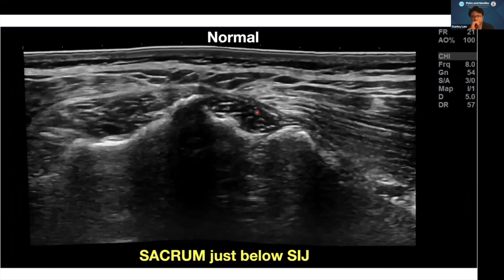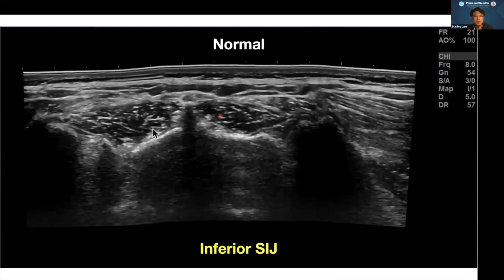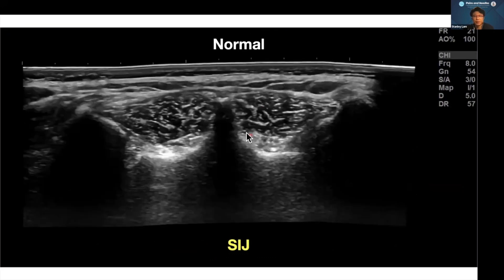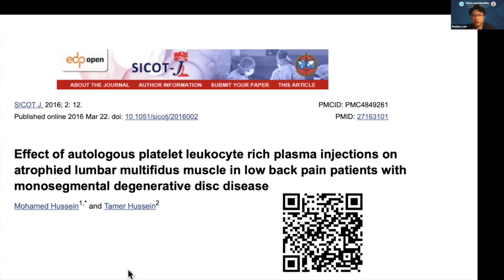For comparison, this is the sacrum of a normal individual — my own lower SI joint. You can see my multifidus and gluteus maximus. Pay attention to the echogenic pattern of my multifidus compared to that patient — it's very different. For this patient, I did an autologous leukocyte-rich platelet-rich plasma injection into the fatty, atrophic lumbar multifidus muscle.